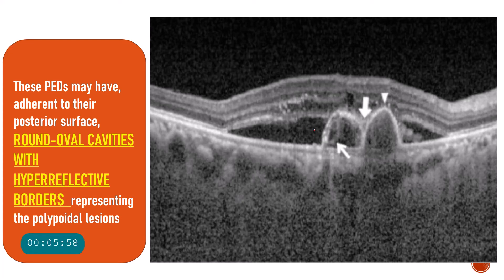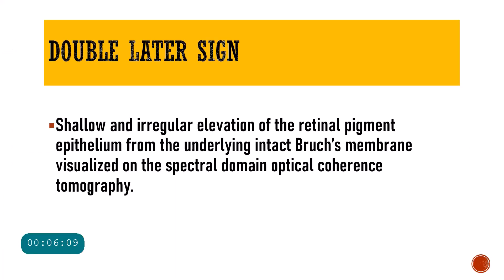Sometimes within the pigment epithelial detachment you will see certain round oval cavity-like lesions. These round oval cavities with hyper-reflective borders are nothing but the polypoidal lesions.